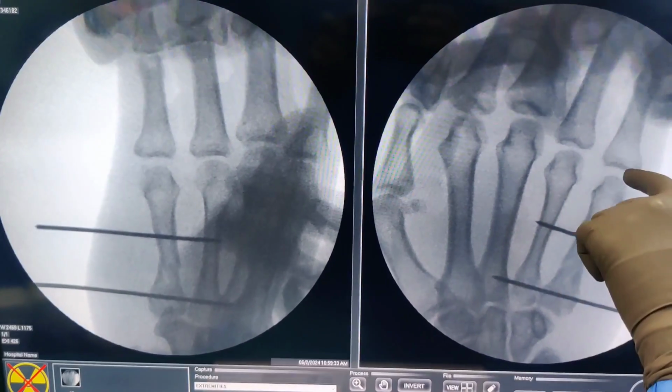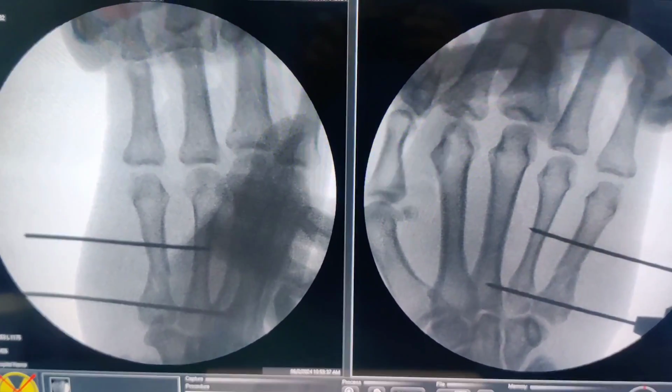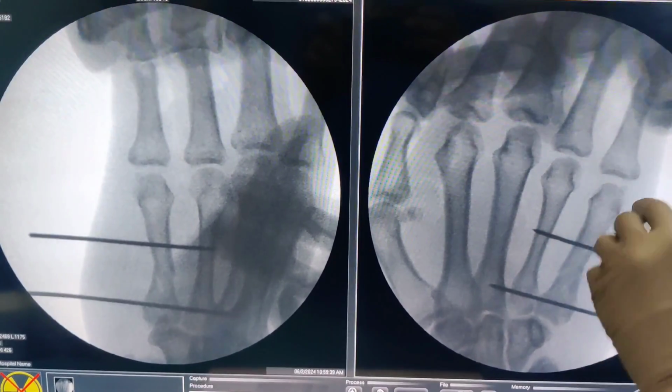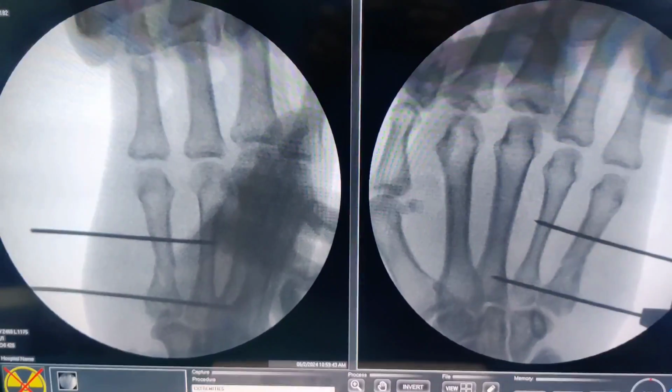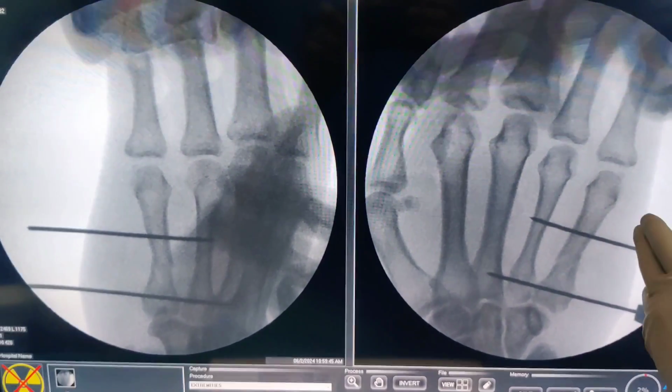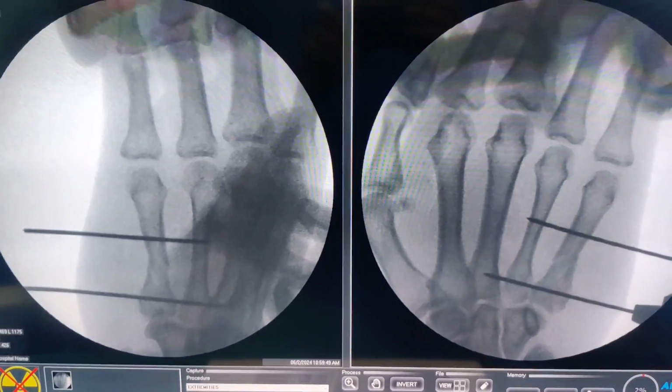Now if you see the height, if you compare it with the pre-op, you have gained the height, so the knuckle will not be flat. The alignment is reasonably acceptable. All you need to do now is to cut the wire, and then we take it off at around 3 to 4 weeks. So this was a demonstration of how to fix a metacarpal fracture, the 5th metacarpal fracture, using transfixation technique with 2 K wires.